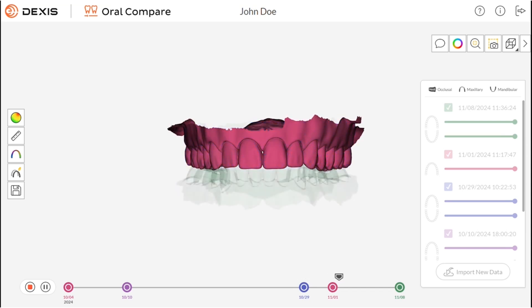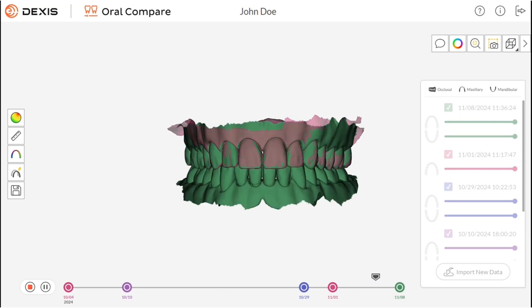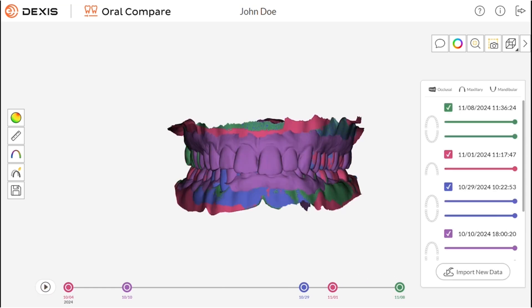This enables practitioners to visualize the progression of these conditions, enabling a proactive approach to oral health.